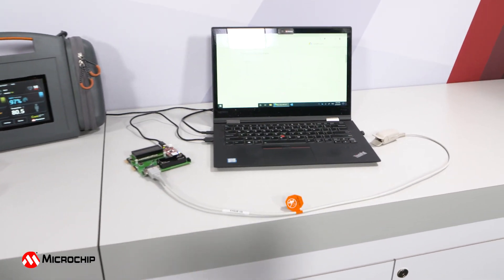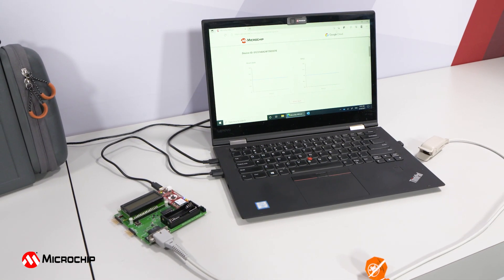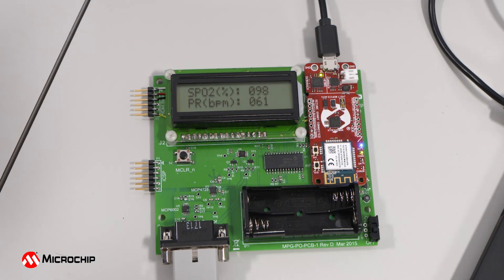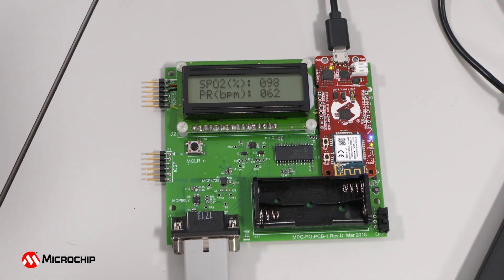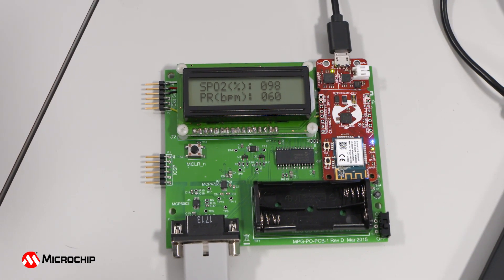In this video, we'll show you how to measure heart rate and blood oxygen saturation and how to securely send the measurements to Google's Cloud IoT Core Platform. This is accomplished by using our Pulse Oximeter Demonstration Board along with our AVR-IoT-WG development board. So let's take a closer look at the features of this demo.